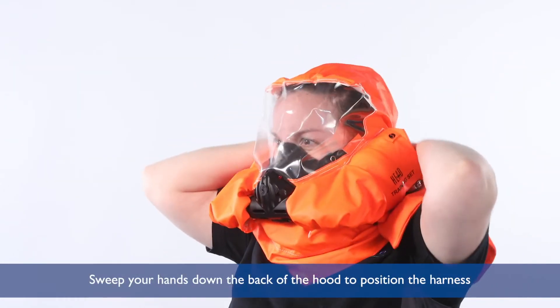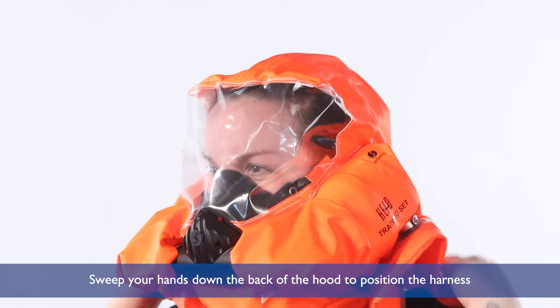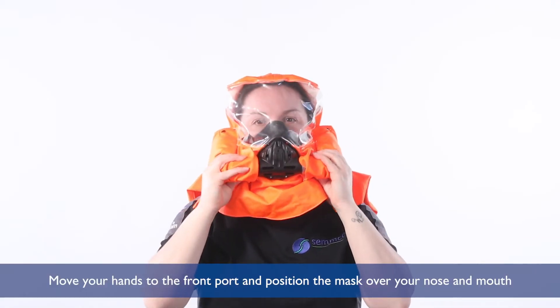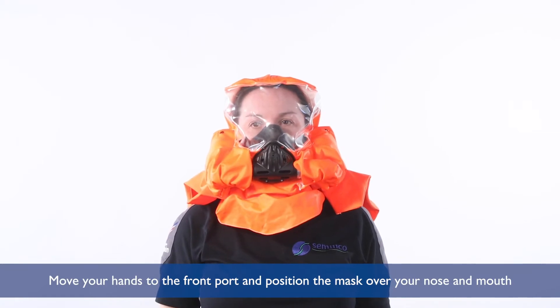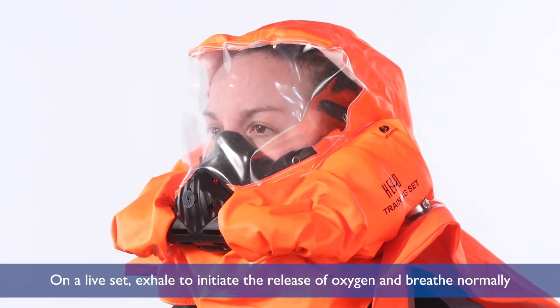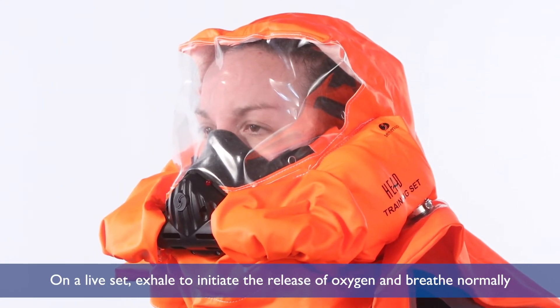Sweep your hands down the back of the hood to position the harness. Move your hands to the front port and position the mask over your nose and mouth. On a live set, exhale to initiate the release of oxygen and breathe normally.